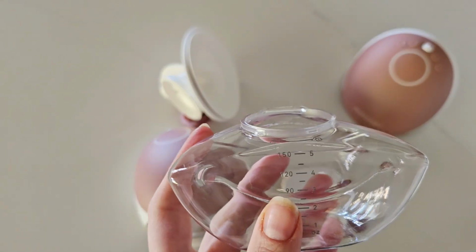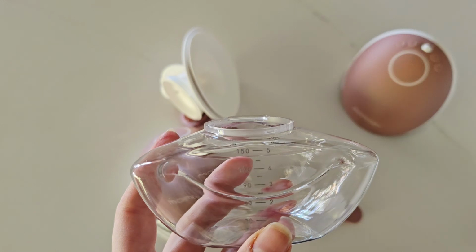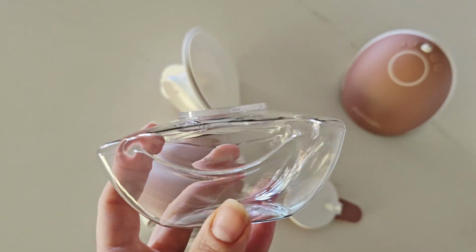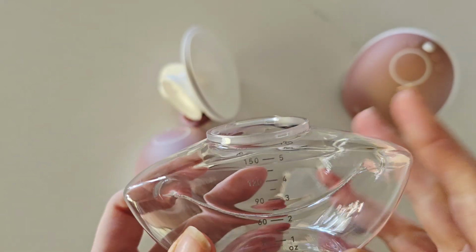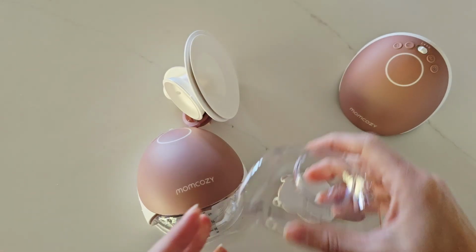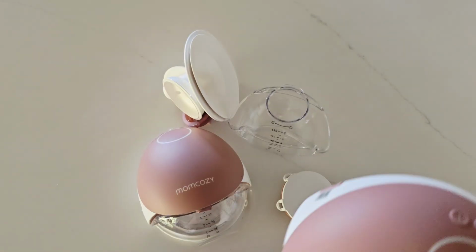And then we have your bottles. Now your bottle comes with a lid when you are replacing it from the official Momcozy store. And these generally around 6 months. But again, any discoloration, any warping, any scratches, you will need to replace these straight away. And then you have your pump motor, which ideally won't need to be replaced.